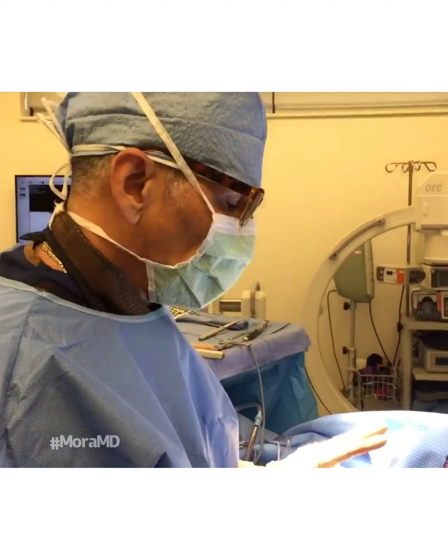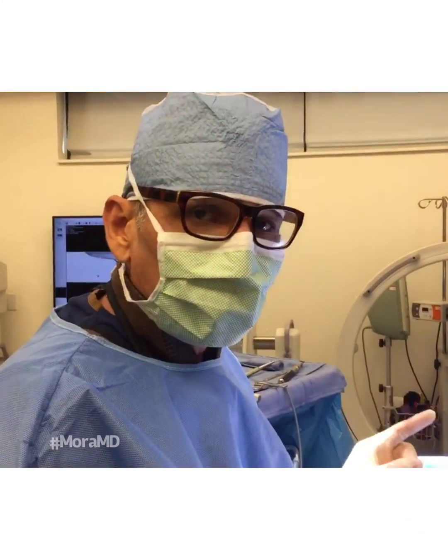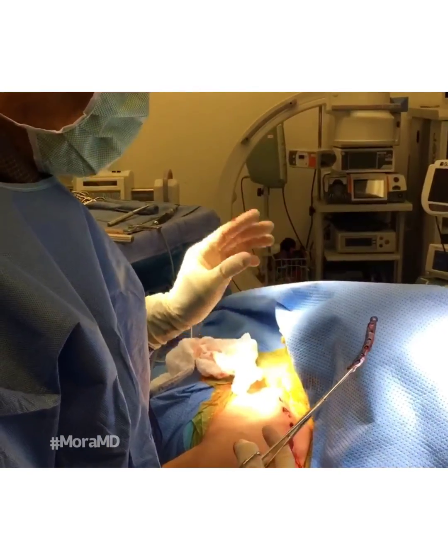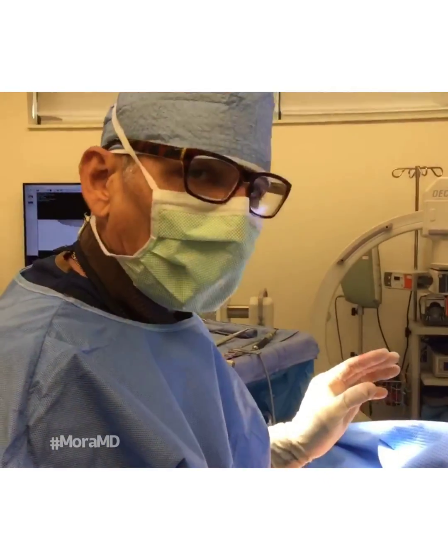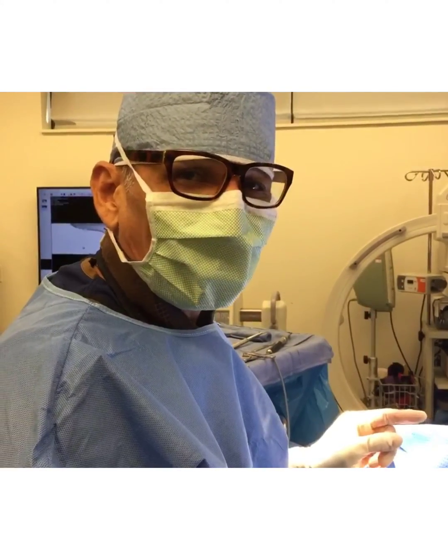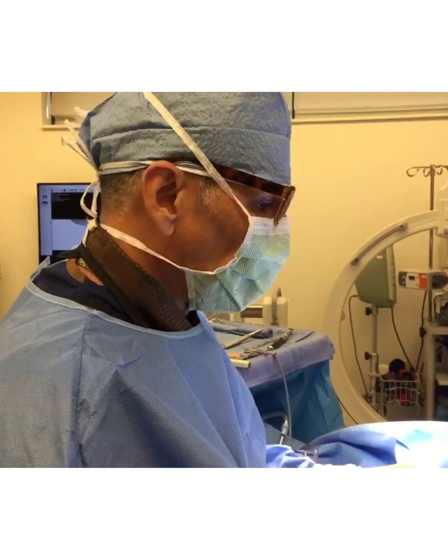Dr. Mora here, doing some hardware removal. It's not as easy as you think — screws break all the time. But fortunately for me, I'm used to working on old cars, so I know how to deal with these situations. You guys take care. Thank you so much.